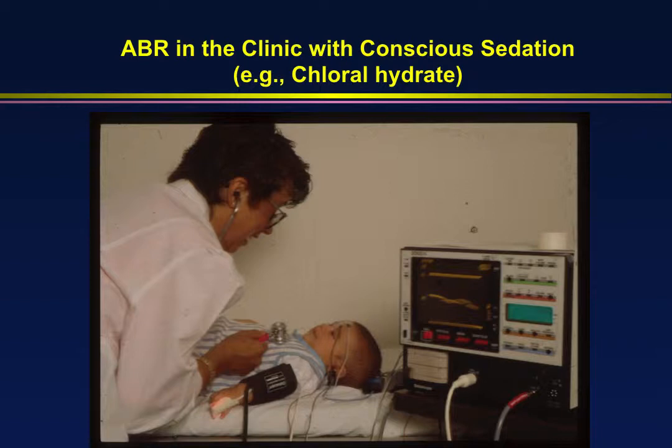Again, conscious sedation is another option. It's quite safe. Very few, if any, contraindications to it. Nothing's going to happen to the child if you follow the proper protocol, but you do need nursing support. You need a doctor in the area. You need a crash cart, a way to achieve an airway if there's a problem, a way to resuscitate the patient, a way to suction out their windpipe if need be. So this is not something you would do in a clinic without medical support.